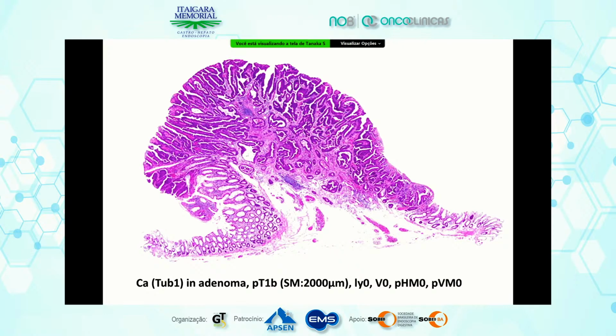When we diagnose the lesion as carcinoma, we have to do EMR or ESD. We should not do polypectomy. Carcinoma shows invasive potential, so we have to get enough submucosal layer tissue, so EMR is important. If we conducted polypectomy, cutting edges like this and deep margin positive.